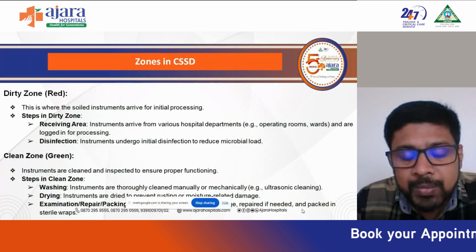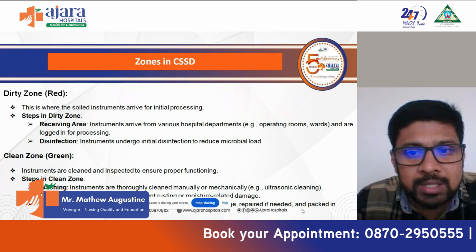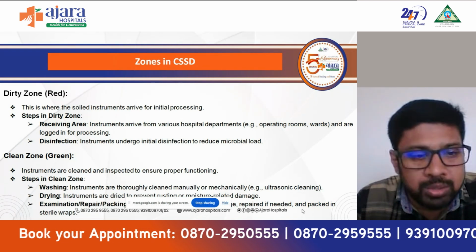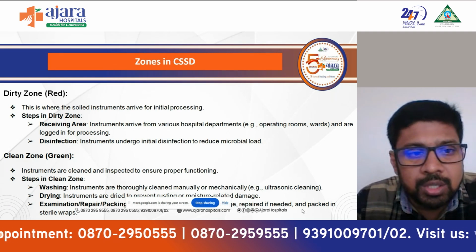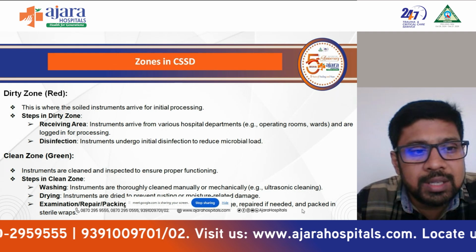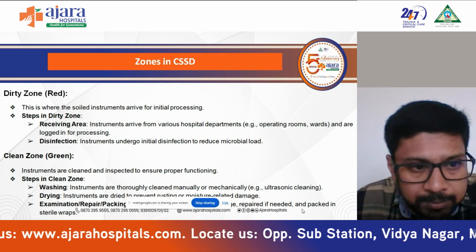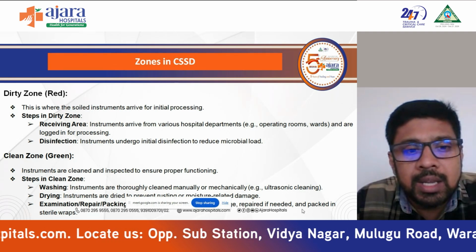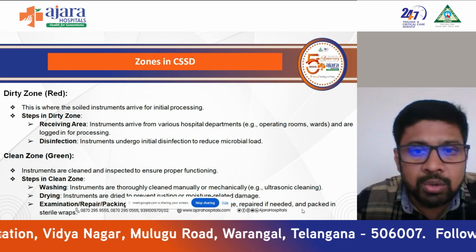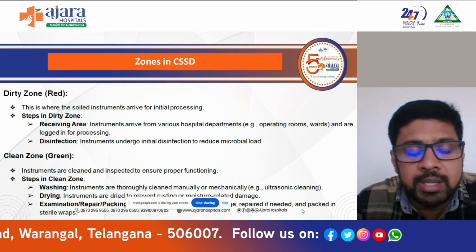We use the proper solution. Disinfection is not the complete removal of microorganisms; it reduces the microbial load before sterilization. So we need to go for the disinfection in the dirty zone. Then we come into the clean zone, for which we have given the green color code. Instruments are cleaned and inspected to ensure they are functioning, that the instrument is in proper functioning condition.